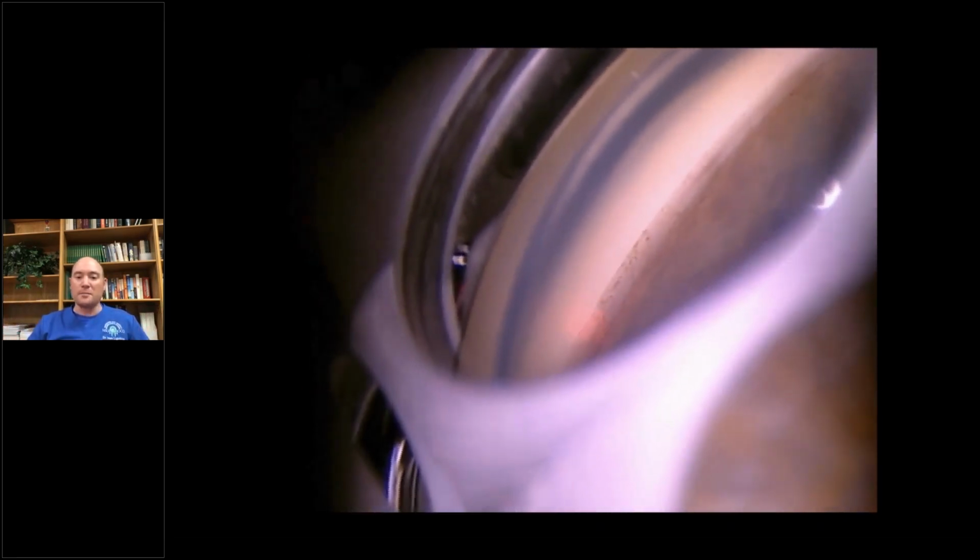We did the top mirror, the right mirror, the bottom mirror, and now we're in the left mirror. And once we get to the end of this mirror, here's our one mirror rotation right there. That's it. And now we're in the obliques. We're ready to go on mirror number 5.